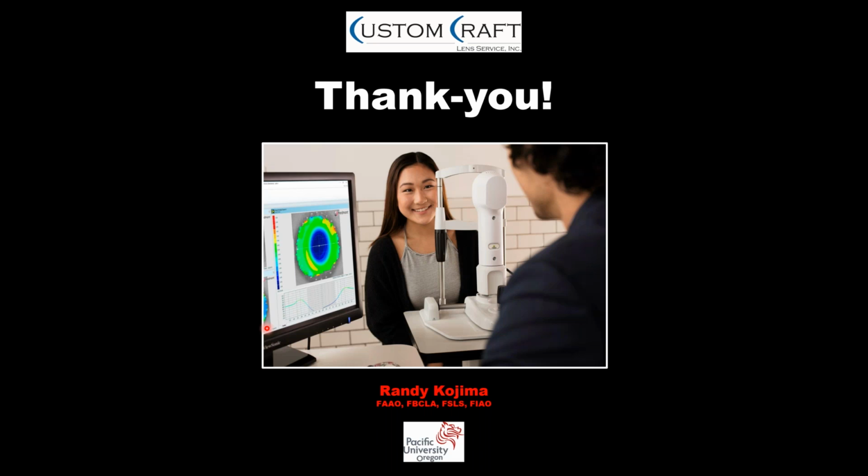I'll try things like having the patient blink really hard and trying to squeeze some meibum out and getting something across the anterior surface that'll keep the surface from drying out so fast. But if a good hard blink doesn't work, if blinks relatively quick don't work, so maybe every 2-3 seconds, trying to get a capture in that narrow window, if that doesn't do it, then really you're right, using artificial tear is the way to go. And something, lastly, sorry, something thin. So you don't want a really thick viscous fluid. You want something thin that won't create shape that isn't actually there.